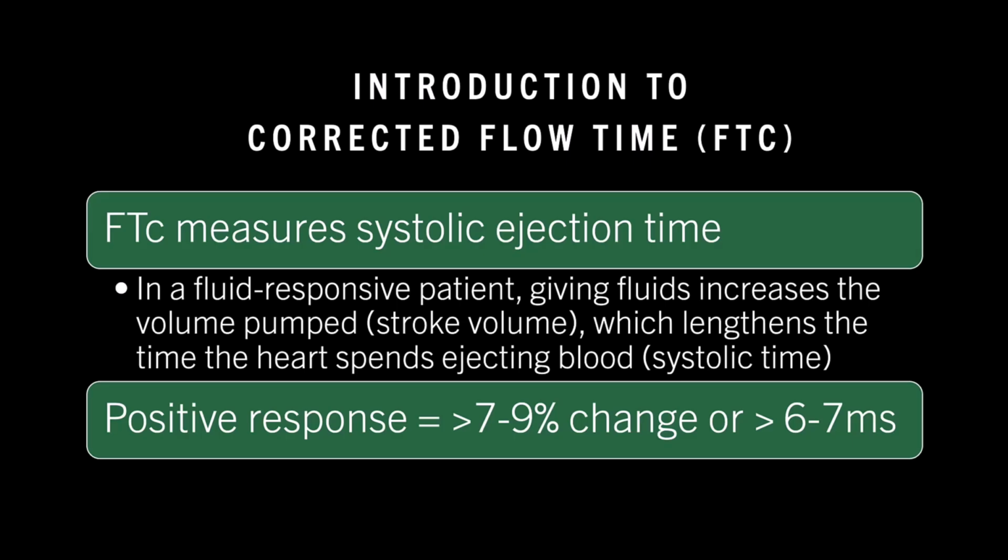So, introduction to the second test that we're going to be learning how to perform, the carotid corrected flow time. This measures the systolic ejection time, which means that we are measuring the time that the heart spends in systole, because in a fluid responsive patient, giving fluids will increase the volume pumped, meaning the stroke volume, which lengthens the time the heart spends ejecting blood, or the systolic time. So we are tracking change over time in response to a physiologic maneuver. We're looking for around a 7 to 9% change, or greater than a 6 to 7 millisecond increase, to define a positive response.